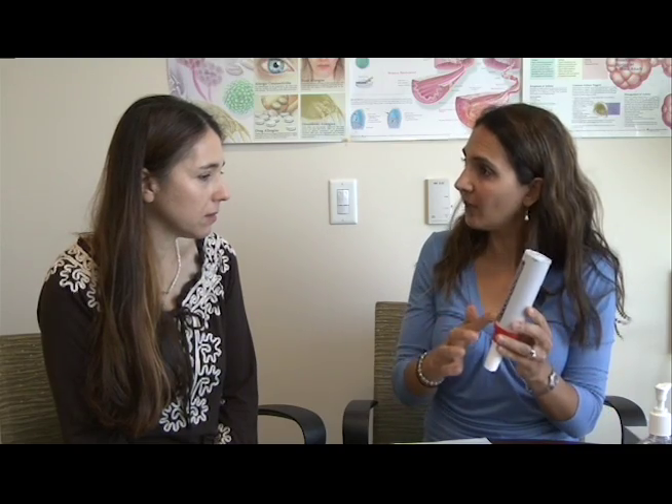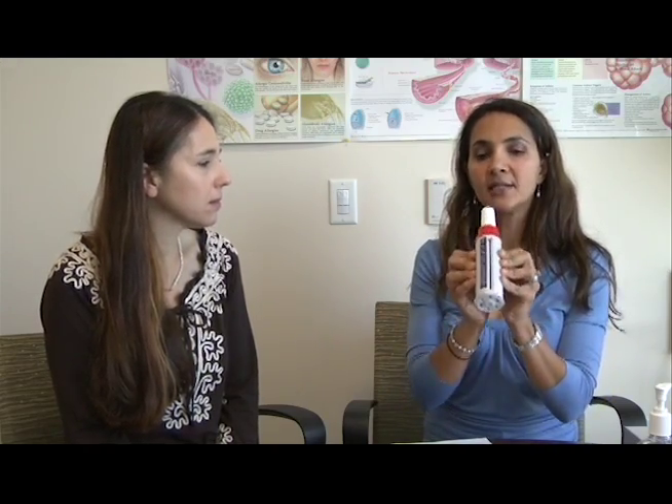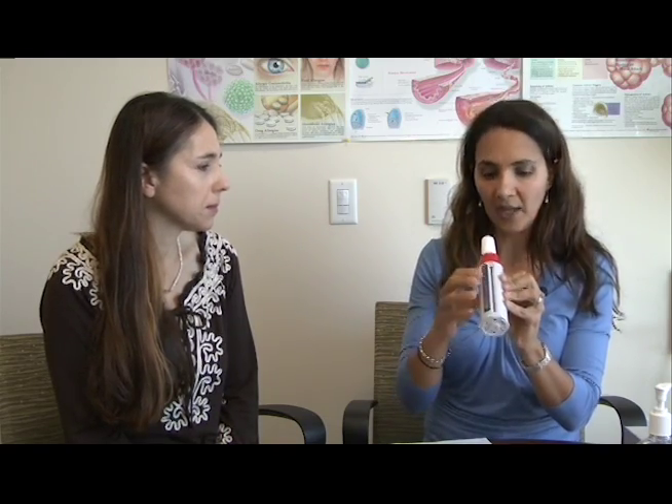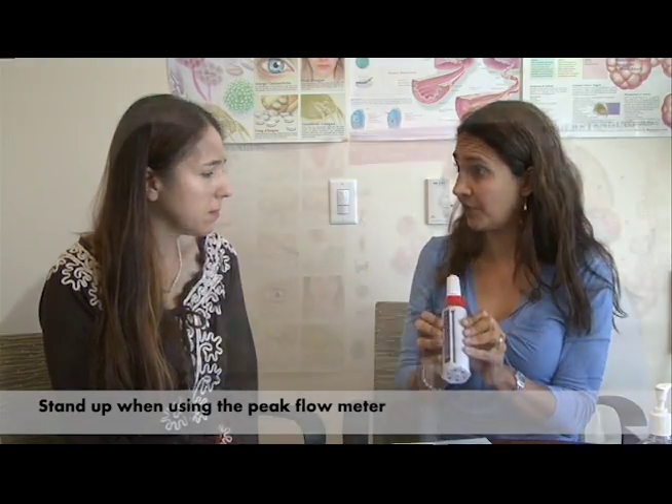To use it, you would push the lever all the way down. When you hold it, you want to hold it horizontally and your fingers need to be out of the way so this lever has a chance to move when you blow. It is very important to stand up when using the Peak Flow Meter.